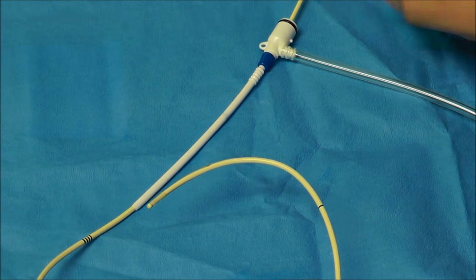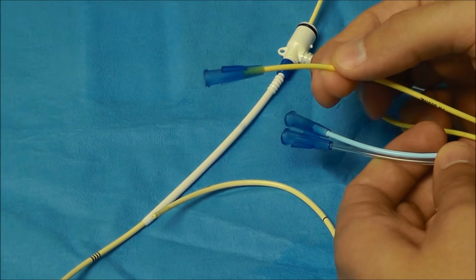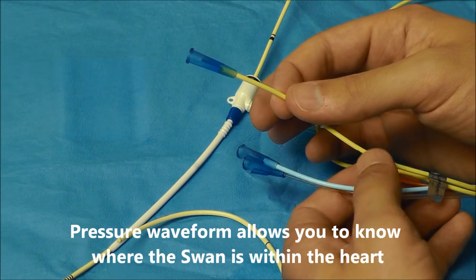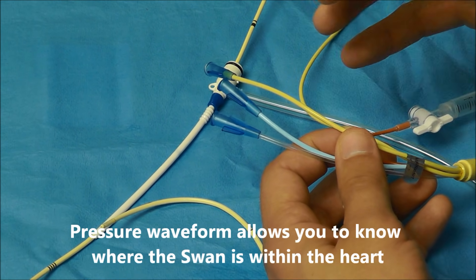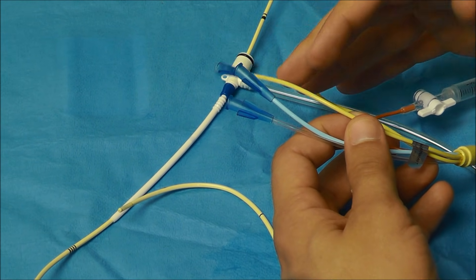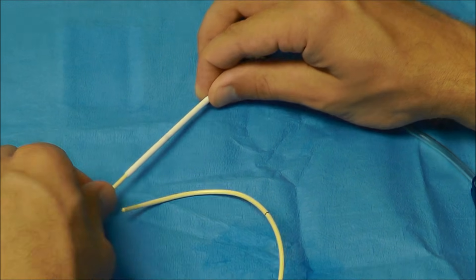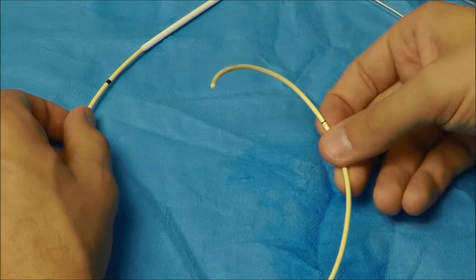you simply just will hook up your Swan-Ganz catheter up here to a transducer tubing, and then you're going to have to watch how the waveform changes as the Swan is guided through the heart. Because the right atrium, the right ventricle, and the pulmonary artery each have a distinct waveform. So if you keep advancing this and all you see is a right ventricular waveform, you're most likely coiled up.